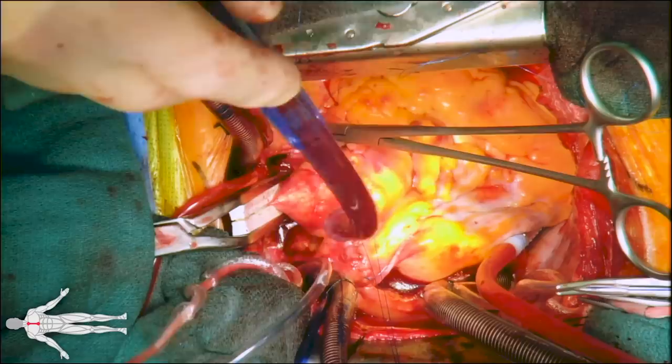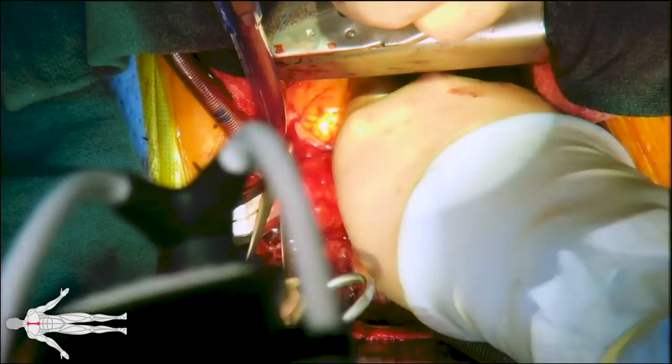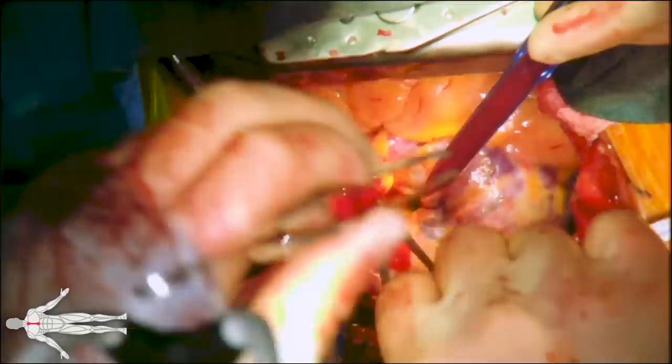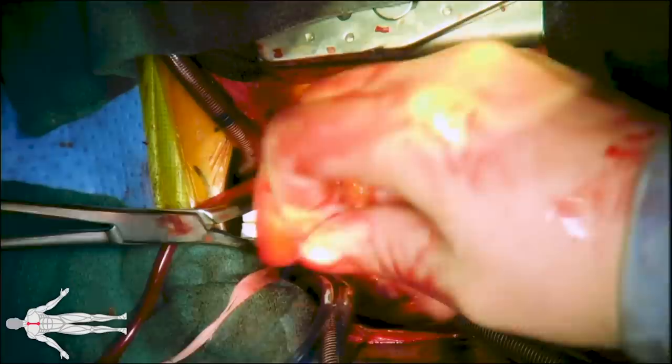Once this anastomosis is completed, the tourniquet on the superior vena cava is loosened and the heart is distended. The heart is de-aired and the pulmonary anastomosis sutures are then tied. This is followed by de-airing the heart one more time and tying the aortic anastomosis sutures.